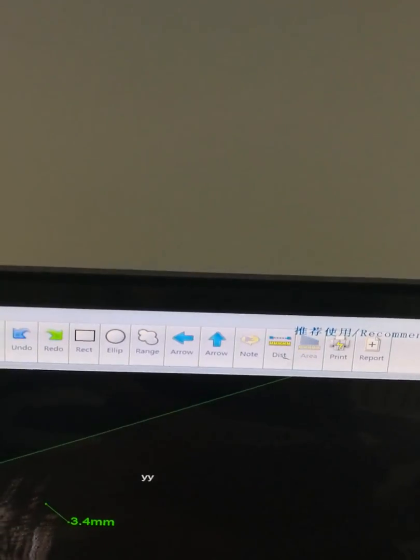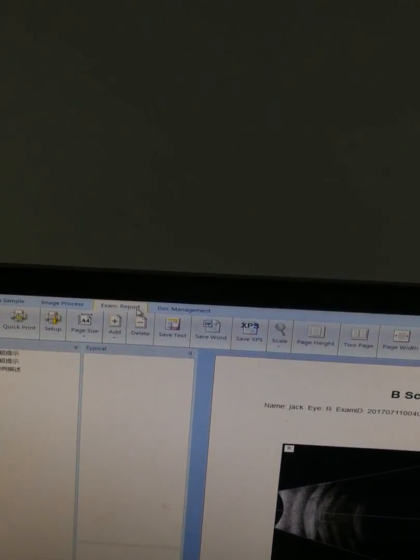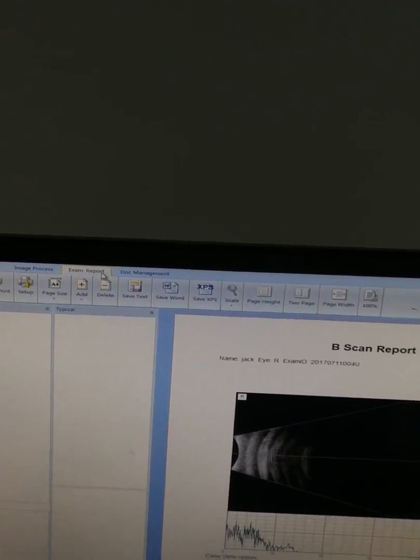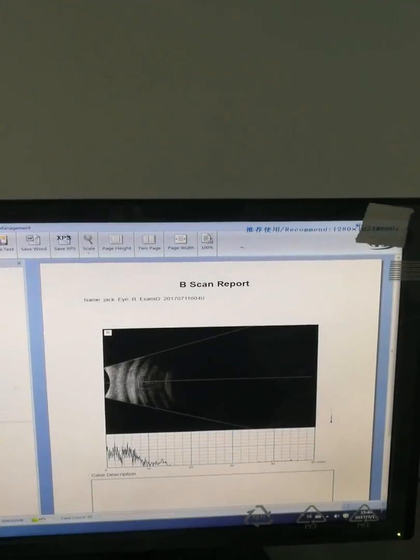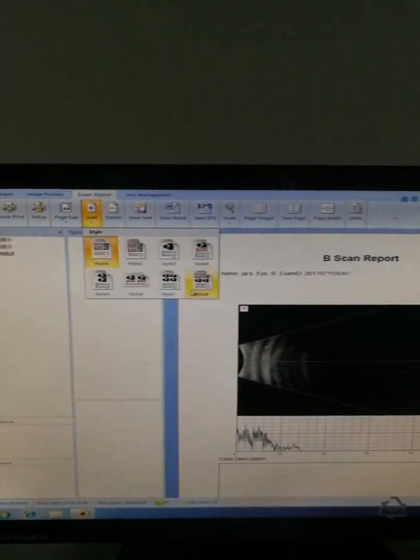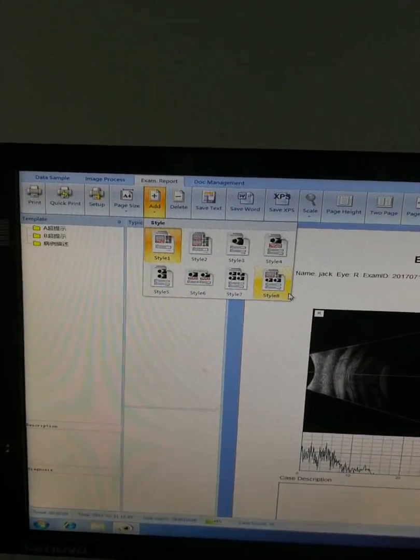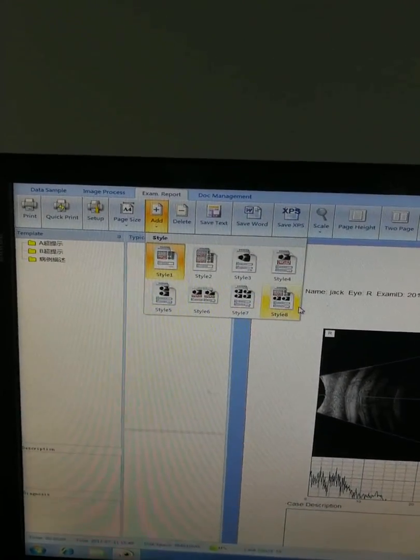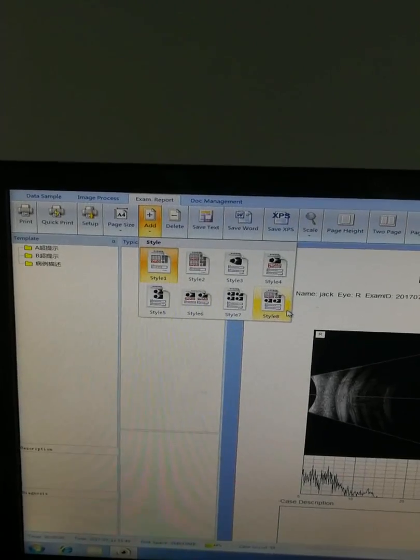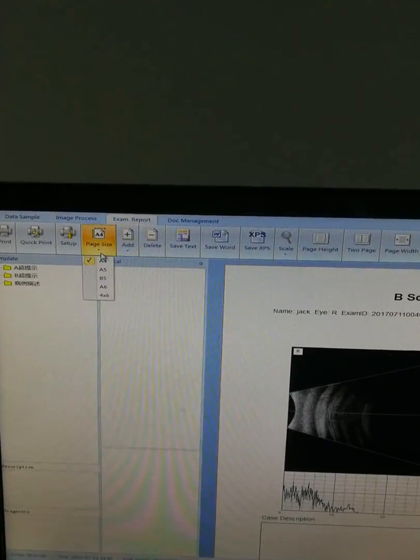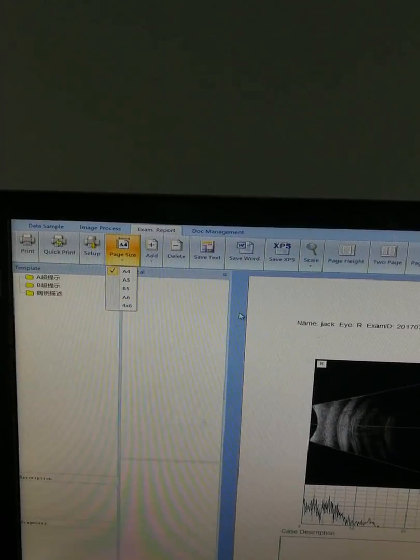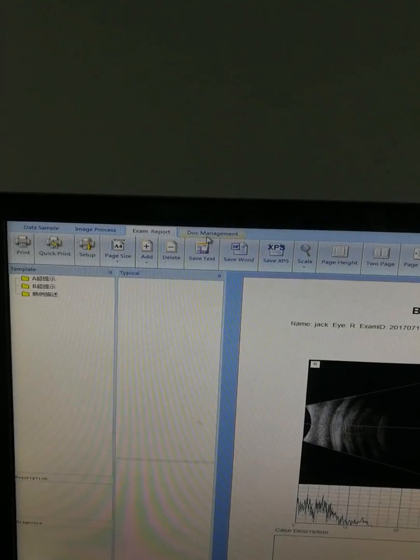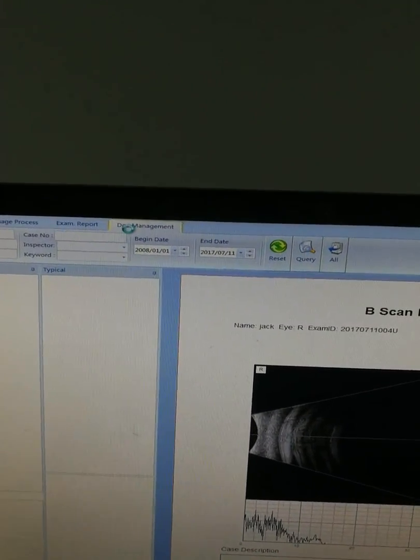This is the examination report. After finishing the test, you can add the report here. There are eight report styles total; you can choose according to your requirements. Here you can choose the paper size. The last part is the data document management.